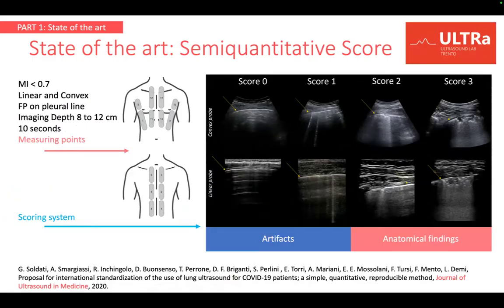And with the standardization, what I mean is standardize the imaging test settings. So you see here, for example, a standard acquisition protocol we developed for COVID-19. Also standardize the areas where you want to scan, meaning how many scans do you want to take and in which part of the thorax. Standardize also the connection between the imaging patterns and the score. And again, this remains subjective and qualitative to a certain extent, but is still useful clinically.